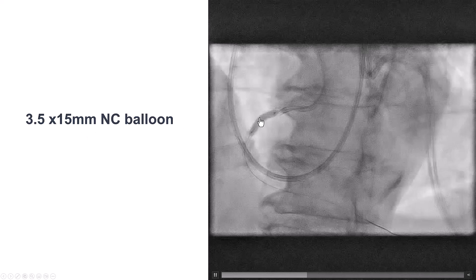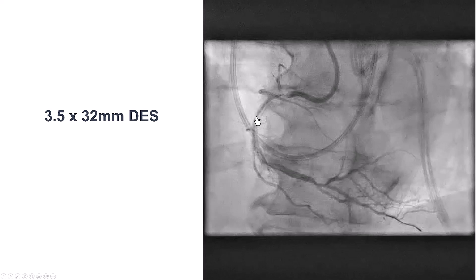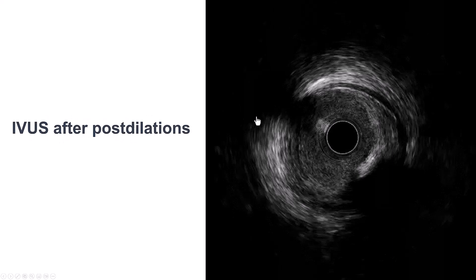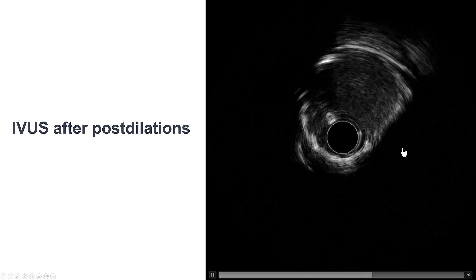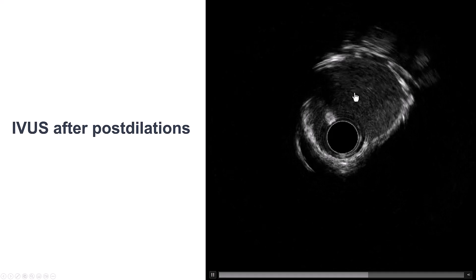He did receive a 3.5 by 32 millimeter drug-eluting stent, and that was post-dilated at high pressure with an NC balloon with a nice result. IVUS is important again, and we do see that there is good stent expansion, there is still calcification, there is oval shape of part of the vessel, but the area is actually good. So overall, we were satisfied with the result.